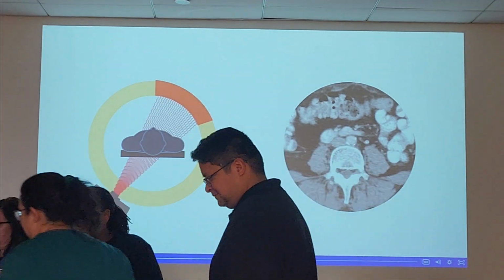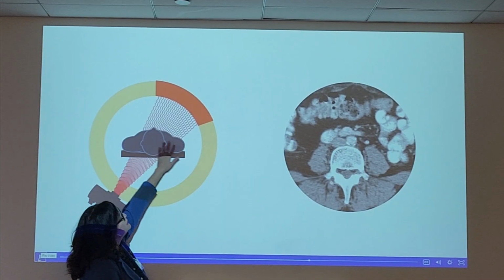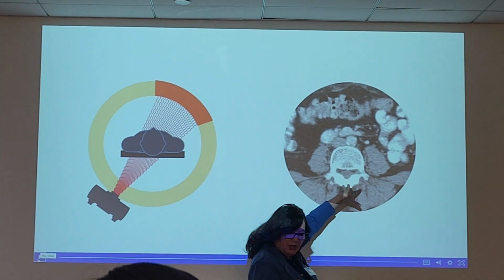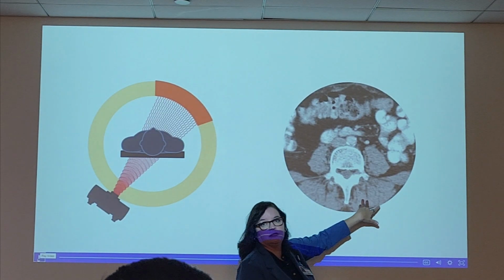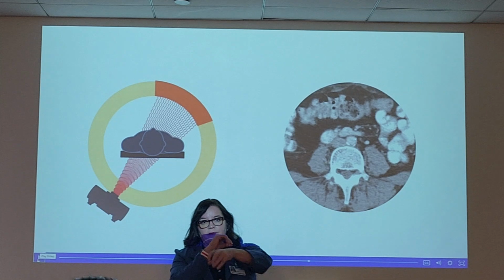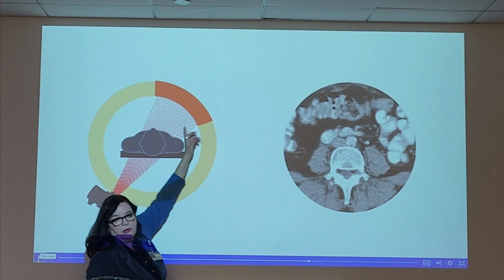Perfect. All right. So when tissue density comes into play, yes, our X-ray beam is going to encounter some of this compact, highly dense tissue because bone is tissue, correct? Is bone tissue? Bone is tissue. So is fat. So is soft tissue. So is lung. All of that is tissue that makes us up. Got it? The more compact, the likelier it's being absorbed in the body, depending on the energy.